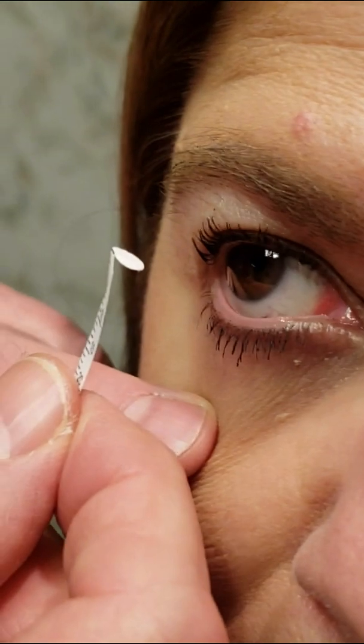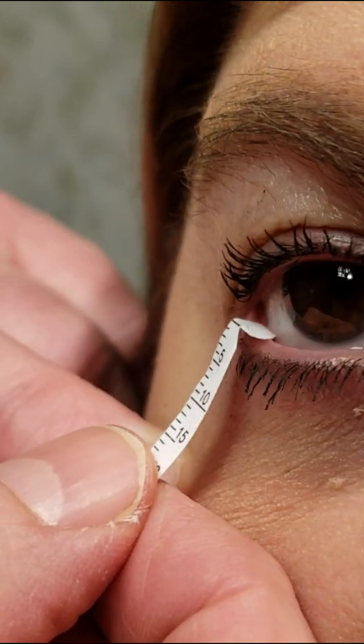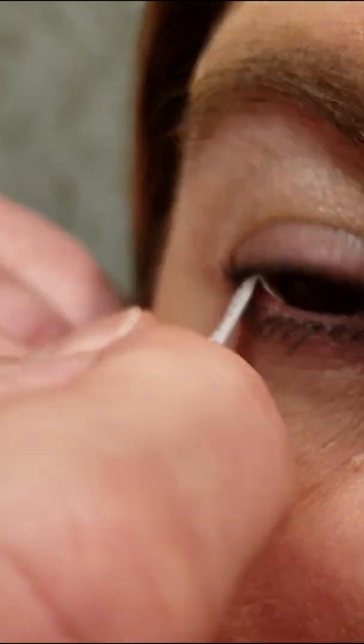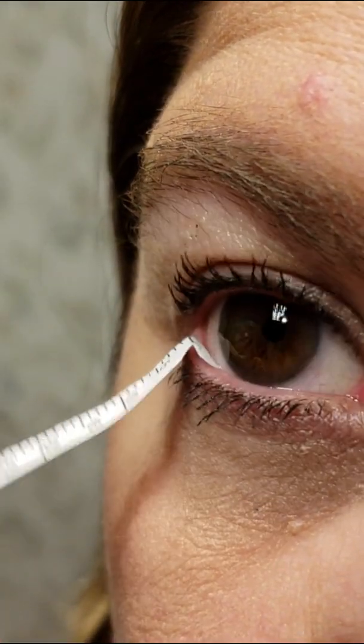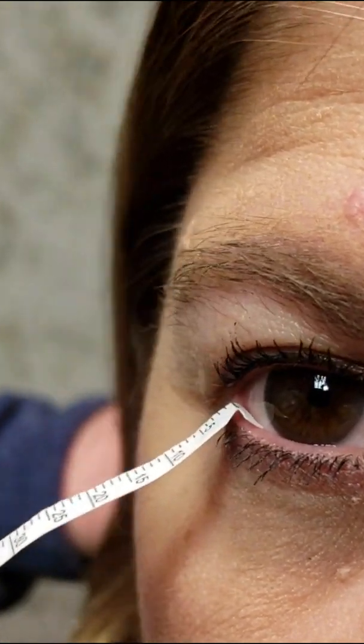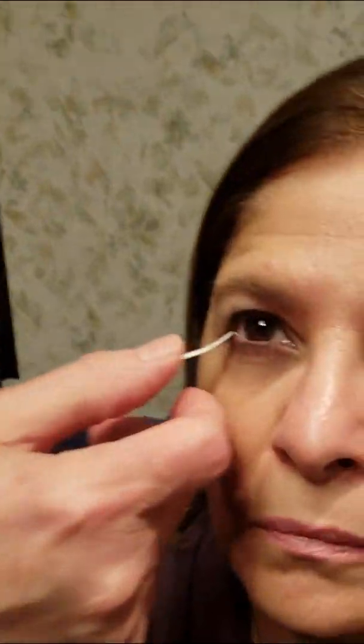Okay Debbie, go ahead and look up to the ceiling, look straight upwards. You can blink anytime you feel like it, but it'll be a little irritating. Usually people are able to saturate this in a matter of seconds, but somebody with Sjogren's syndrome may not saturate it at all and they may really be dry. It's good if somebody is totally dry, but it's irritating enough that most of the time it's not very accurate. Of course, we could do this with anesthetic too, but this would be a baseline.